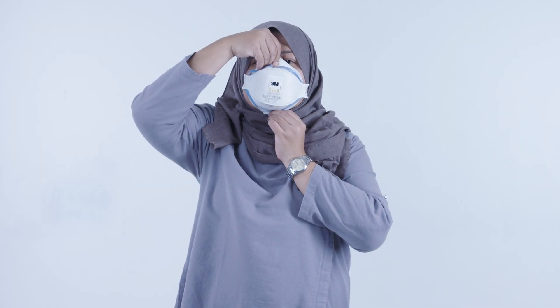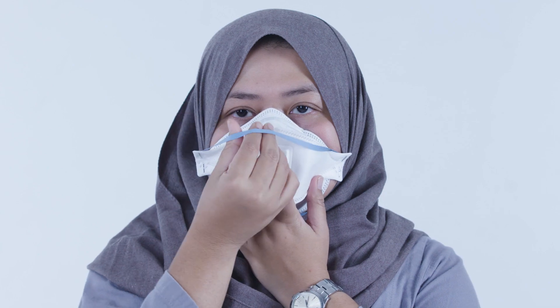If you wear glasses, take them off to fit the mask. Hold the mask over the nose and mouth. Fit any strap to the head with the top strap around the top of your head above your ears. If the mask has ear loops, put these over each ear.